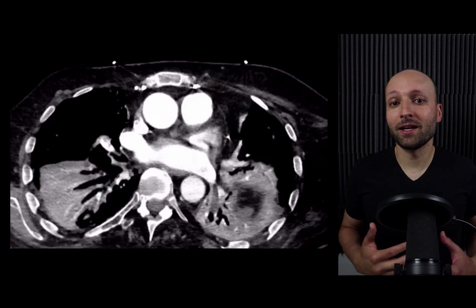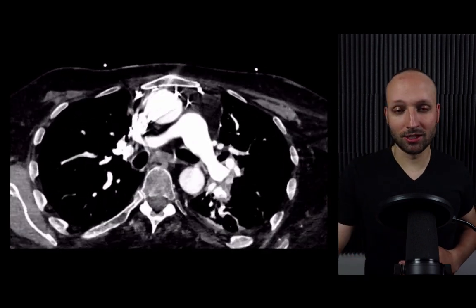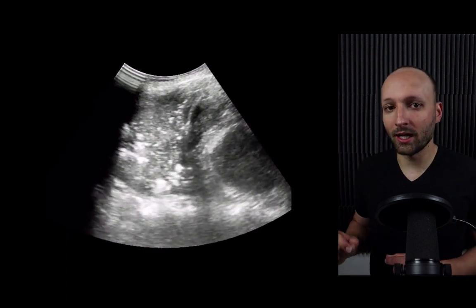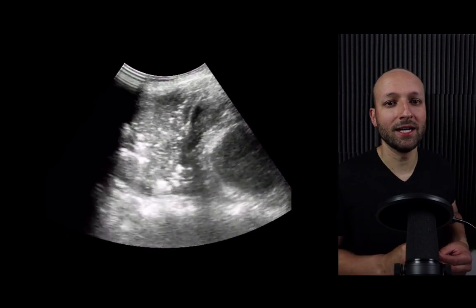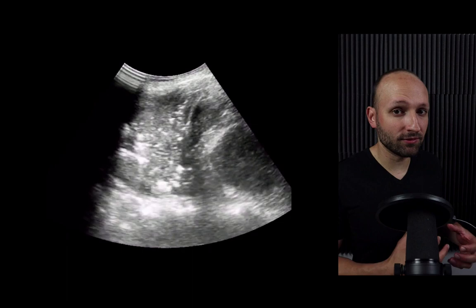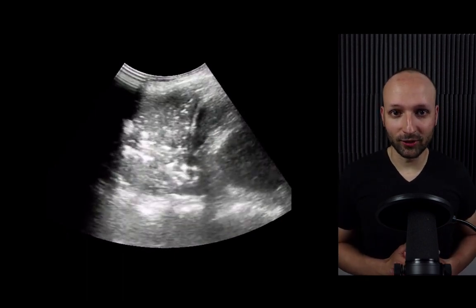And in fact, I've had 3 people in my entire career out of thousands of people that I've scanned that have said no thank you when I asked them about ultrasounds. Learning about lung pathology, which is actually my favorite application of ultrasound, I learned that via diagnosing it with a CT scan or an X-ray, and then going back with that ultrasound and trying to figure it out retrospectively. It's a good way to learn. Remember, especially if you're just starting out, the point of you doing the scans retroactively is not necessarily to change patient care. It's to be able to increase your ultrasound knowledge and learn a little bit more.